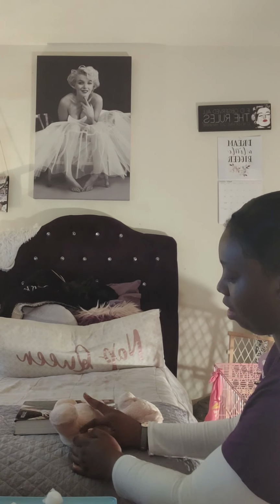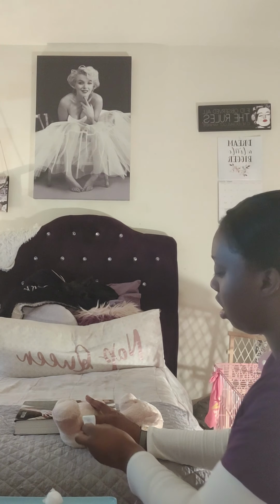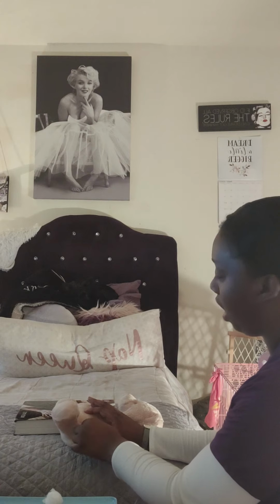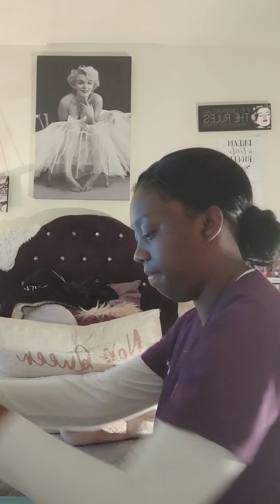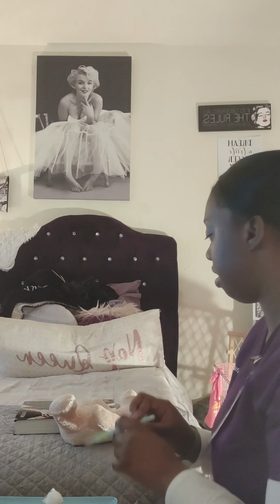Right there. Alright, so once you've found the area, go ahead and cleanse the area with the gauze, inward to outward, allowing the area to dry. Take your needle and uncap it.